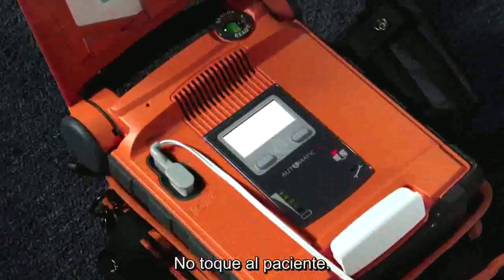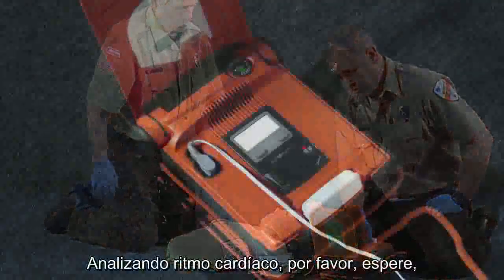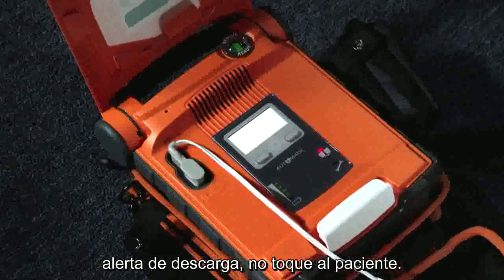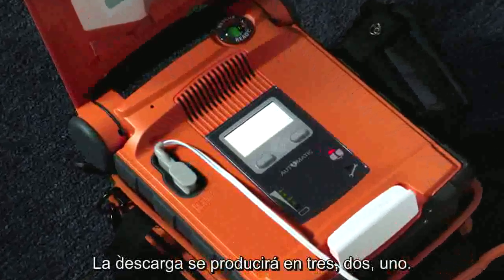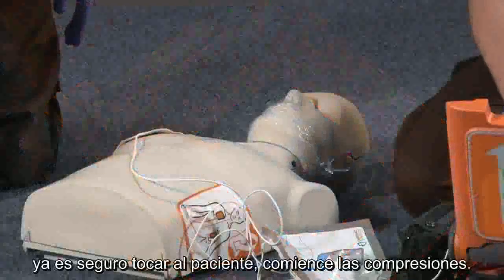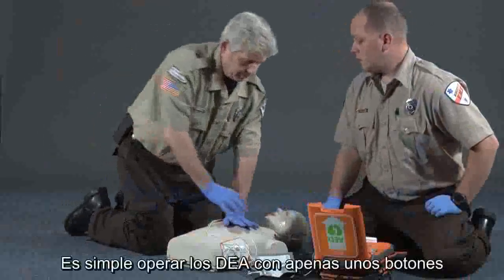Do not touch the patient. Analyzing heart rhythm. Please wait. Shock advised. Do not touch the patient. Shock will be delivered in 3, 2, 1. Shock delivered. It is now safe to touch the patient. Start compressions.